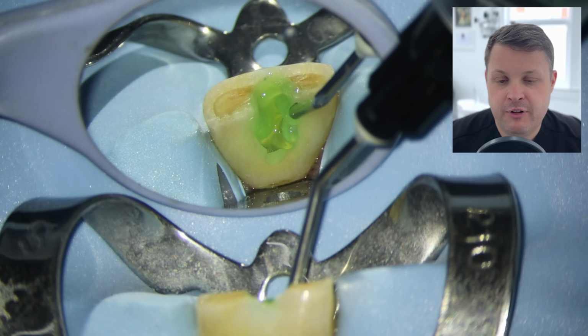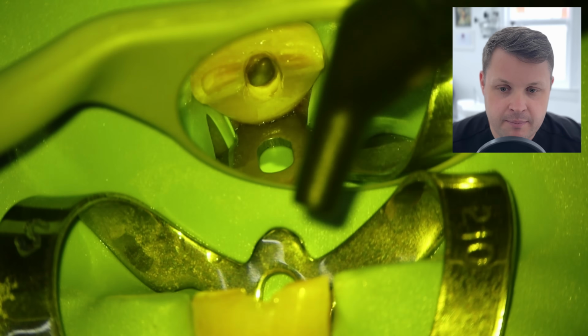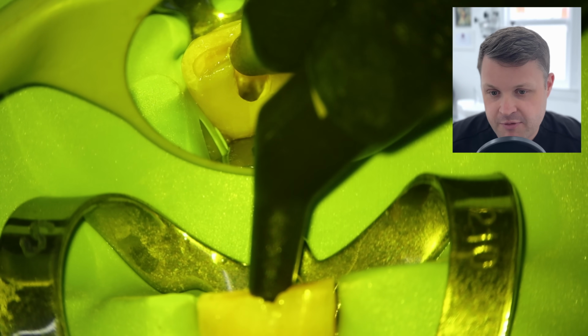I am not going to fill this tooth conventionally, because obviously, don't forget, I've drilled down the centre of this tooth, down the incisal edge. So the patient actually complained that it looked a bit off. He was fine with it, of course.